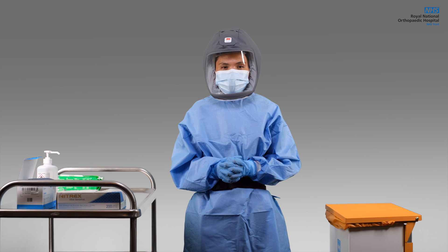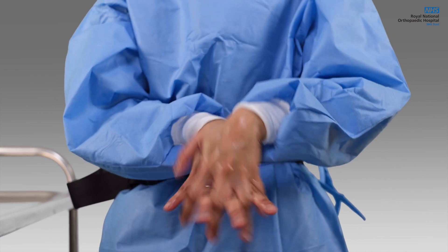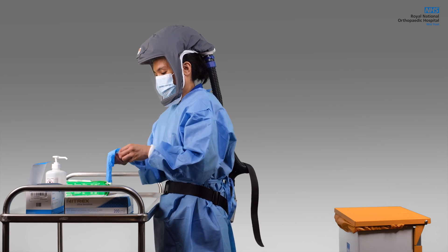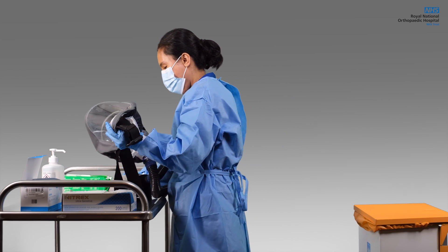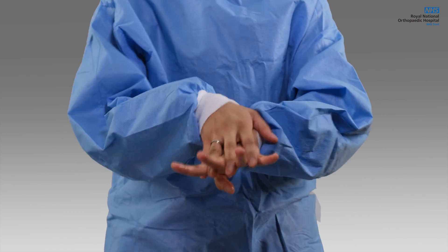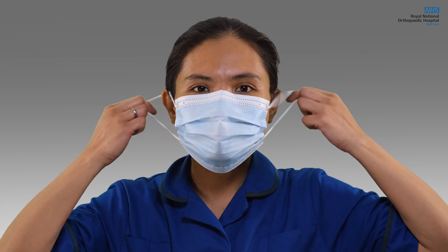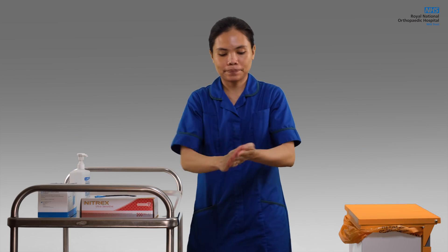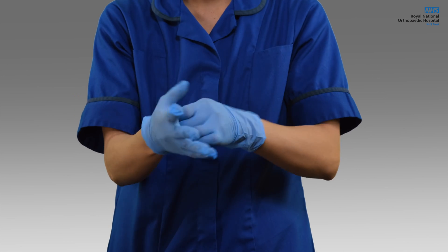After use, make sure you are out of the aerosol generating procedure zone before taking the hood off or turning the unit off. Discard your used gloves appropriately and clean your hands with alcohol hand gel. Use another set of gloves, then turn off the unit by pressing the blue button. Ideally, lay the unit on a table. Take your gloves off, sanitise your hands, then take your gown off. Sanitise your hands and remove your face mask. Sanitise your hands again, then put on another set of fluid-resistant surgical mask and gloves before cleaning the unit.